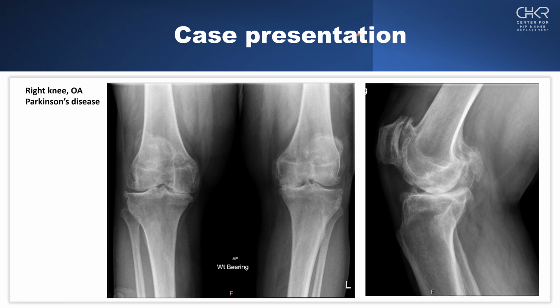Okay, we'll start out with a patient with a severe flexion contracture. We can tell when we look at his films, we're looking at the anterior and the posterior. We can see his tricompartmental disease. We can see his lateral subluxation of his tibia. And if we look at the lateral, he's got severe patellofemoral arthritis with bone spurs or beaking, both in the patella as well as the femoral trochlea, and he's got large posterior osteophytes. So he clearly has a bad knee.